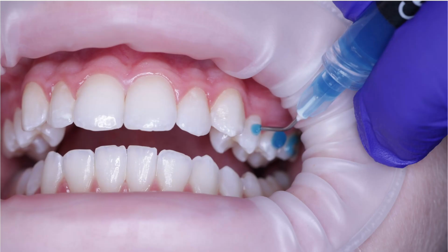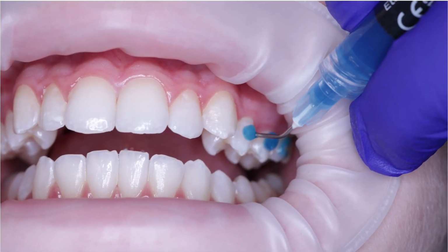Well, the beauty of only acid etching, and this is why you either want to print out your ClinCheck, which you can do, and I've got a little video on how to do that, or you can have the ClinCheck up, looking at myiTero.com, to make sure that we come really close to exactly where those attachments go. And again, we're not perfect, but we want to try to come close to that, right? So this is something that, again, you'll see here.